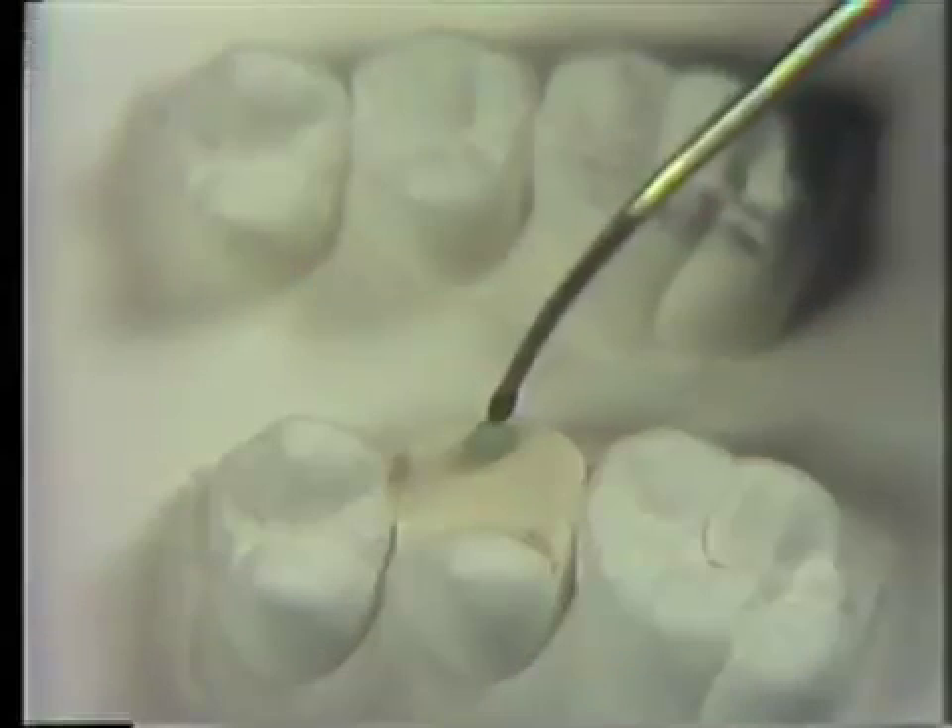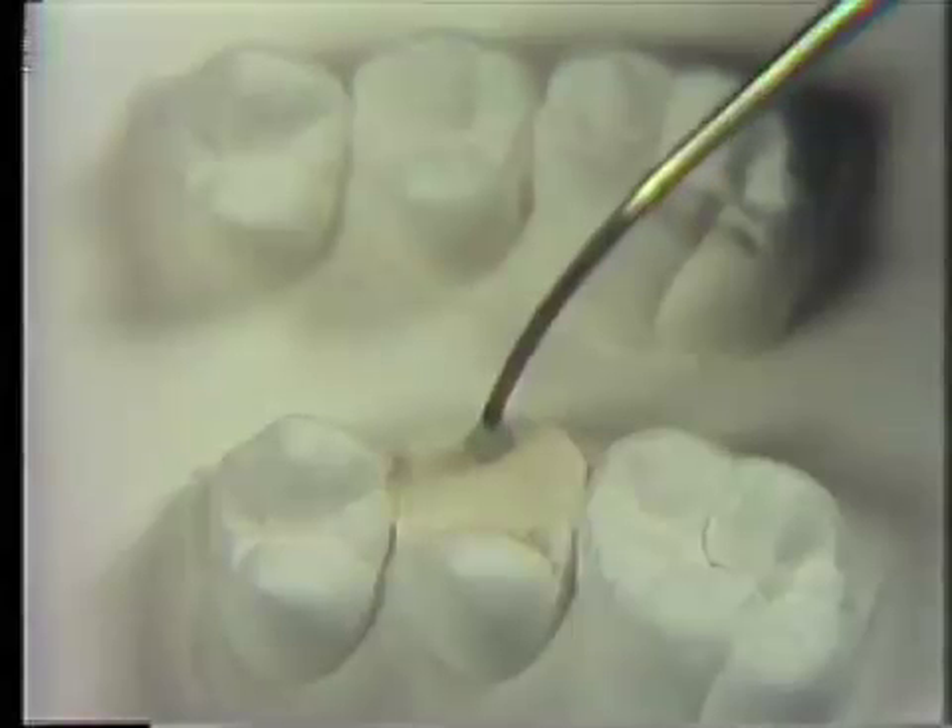The cusp cone is developed using the blunt end of a PKT number 2 to add small increments of wax. Several increments of wax will need to be added until the cusp cone is at the correct height — slightly higher than the lingual cusp cone.